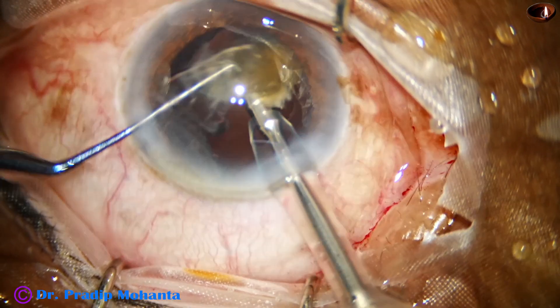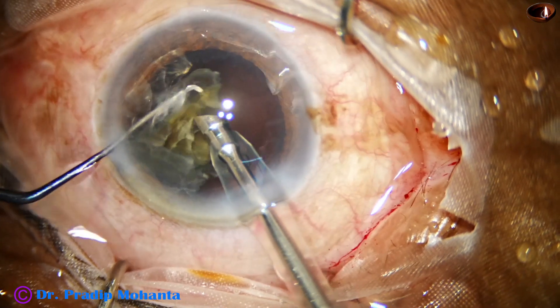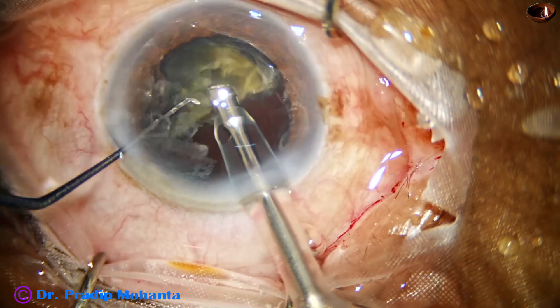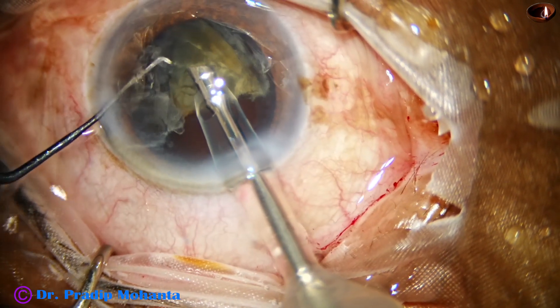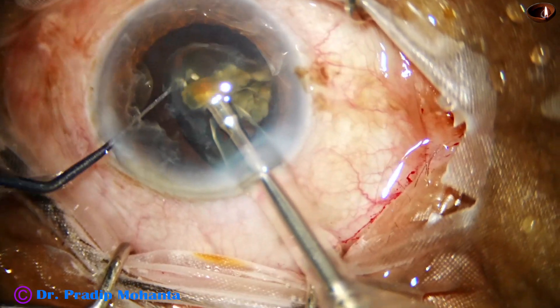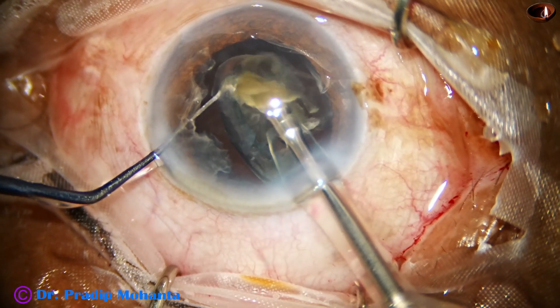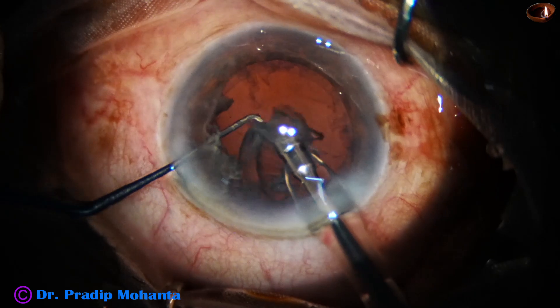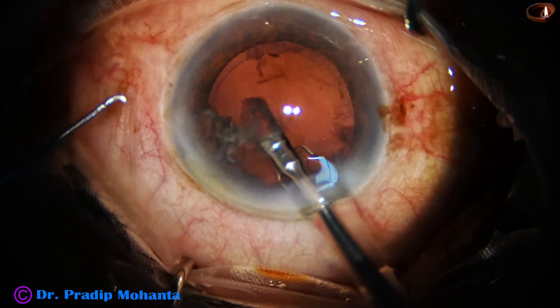Now I come to the other and last fragment. Again, I am trying to hold the nucleus and detach the epinucleus. I pull the nucleus and detach the epinucleus. The nucleus is emulsified keeping the probe at the central safe zone, and then finally the epinuclear shells are removed.